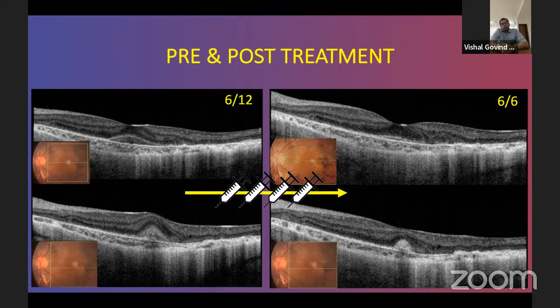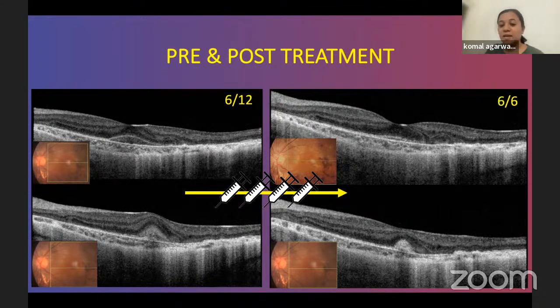Right. We have two different views there, but I guess nothing is black or white in cases like this, and the areas of gray is what we come up with in discussions like this. But it was a very interesting point, Dr. Sharath, that you made, that while we know that OCTA is going to give us more information, getting a good image can actually be challenging.